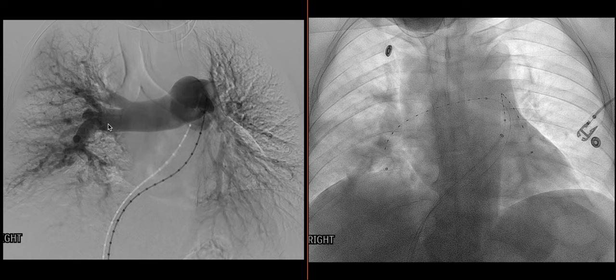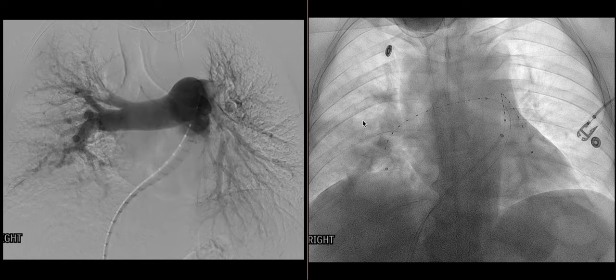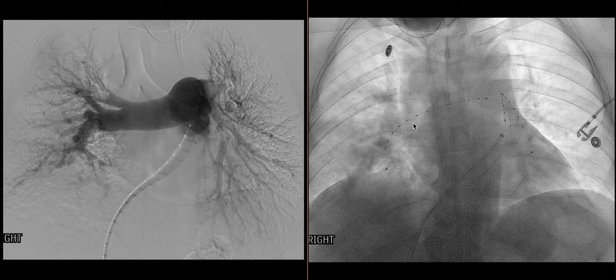For this particular case, they did not do a thrombectomy, but rather placed catheters down both on the left and the right in the pulmonary arteries to perform catheter-directed thrombolysis. This was how the patient was managed — placing those catheters so that the thrombolytic could be delivered more directly to the pulmonary arterial system.